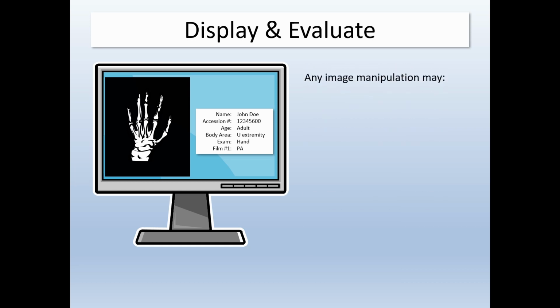Post-processing image manipulation should not be needed. Just a consideration if post-processing manipulation is necessary. For example, I have seen masking errors caused by the computer mistaking a long bone soft tissue interface for a collimation border and subsequently causing the mask to extend over the anatomy. This is corrected by unmasking, drawing a border, and remasking the image.